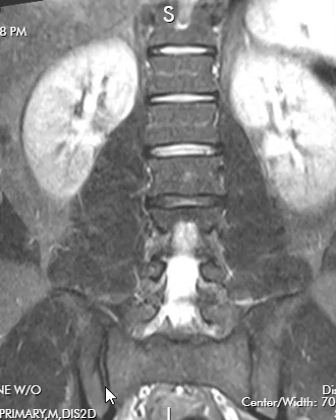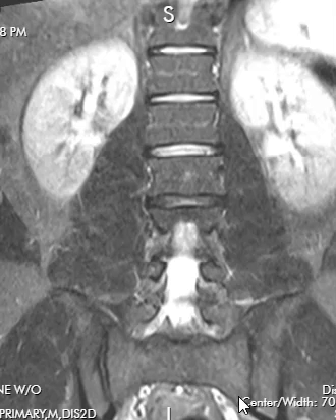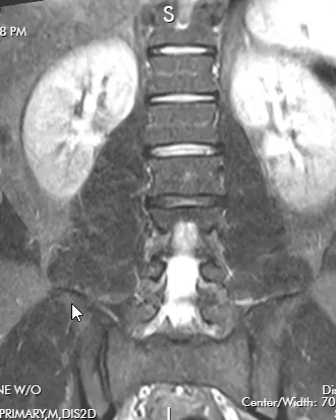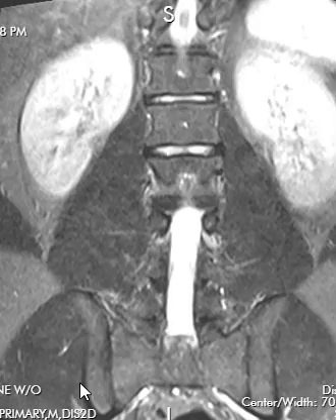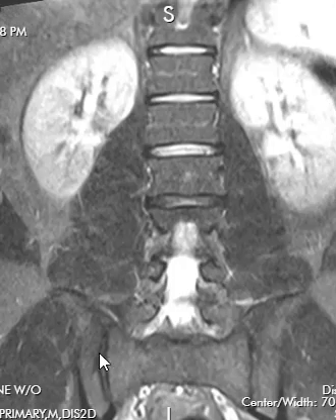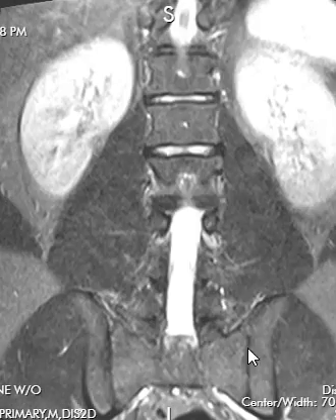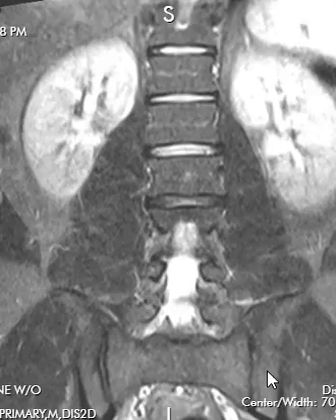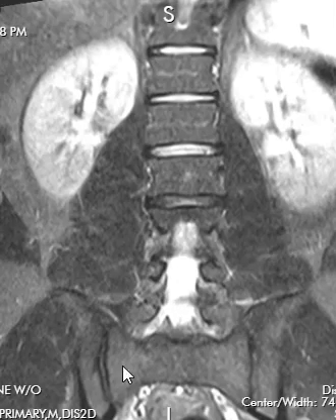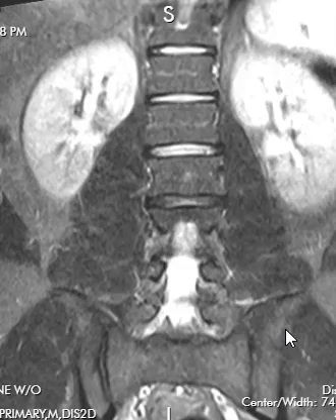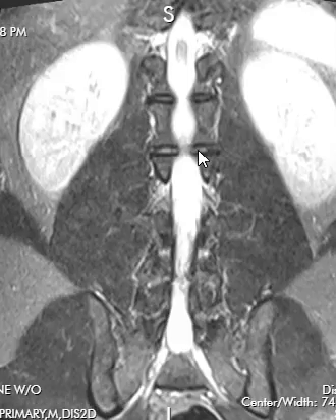On this view we can see the sacrum — here's the right side and left side. The sacrum has the sacroiliac joint: on this side is the sacrum, on this side is the ilium, and this is the SI joint. Both sides look normal — there's no evidence of sacroiliitis and no evidence of a sacral stress fracture or bone tumor. So have a big view, look around, make sure there's nothing going on.